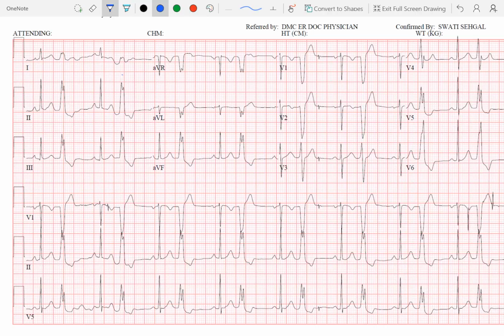Okay. So the question is, if you have atrial bigeminy, then you have a sinus rhythm followed by a P wave that is ectopic, comes somewhere else from the atrium. Okay. And that can conduct to the ventricle with a narrow QRS or a wide QRS in the case of an aberrancy if it blocks in one of the bundles. Okay. So in that case, that would be an atrial bigeminy. And if there is no P wave to make that QRS and it's wide, then you have to assume that it's a ventricular bigeminy. Okay. There are rare instances where you can have a PAC that can be conducted to the ventricle with a pre-excited pattern, but that's pretty rare.